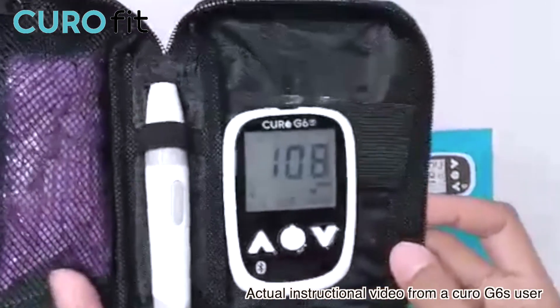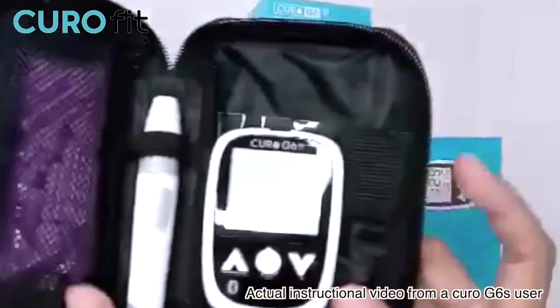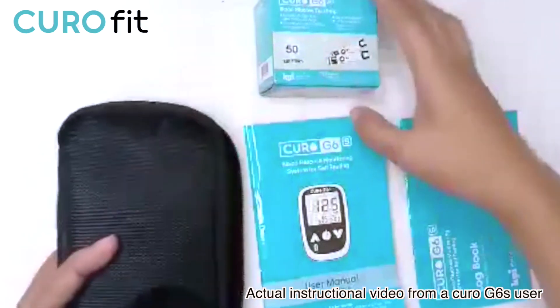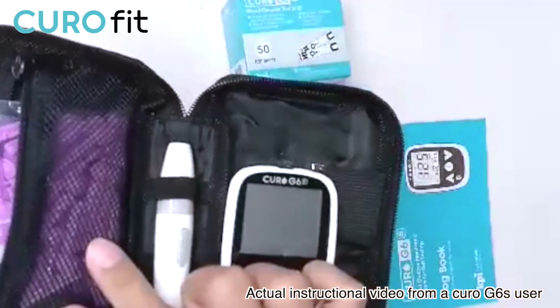This is the Curo G6S kit and you can purchase this online at curofit.com. It comes with a Curo G6S meter — it is so small but very handy. It also comes with free 50 glucose test strips and a lancing device.